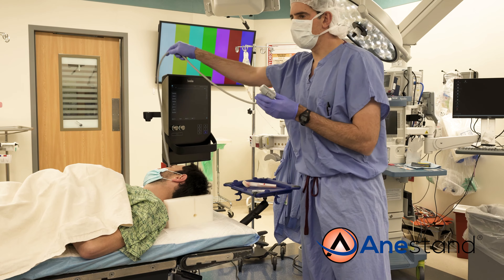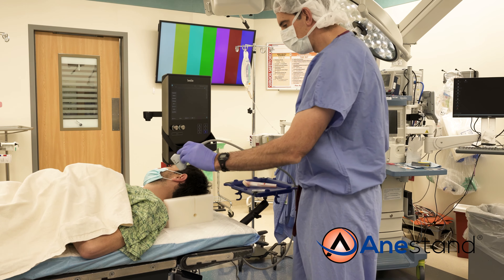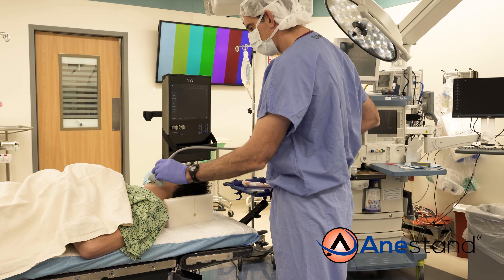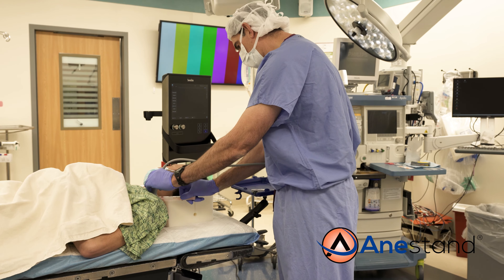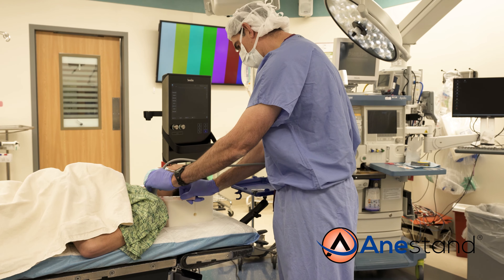As you do your block, your antiseptic wipe and your local anesthetic are immediately available. So when you do your block, you'll look with your probe, easily wipe, inject the skin with the local, and then you're ready for your procedure.